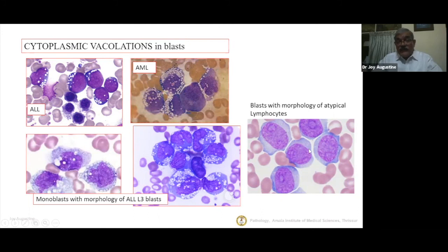And the other point which I want to mention to you earlier regarding the atypical lymphocytes is this. You find large numbers of cells with the skirting and molding, etc., cytoplasm, but all of them have got immature nucleus. You don't find all the other types of atypical lymphocytes, and this is sometimes accompanied by thrombocytopenia.